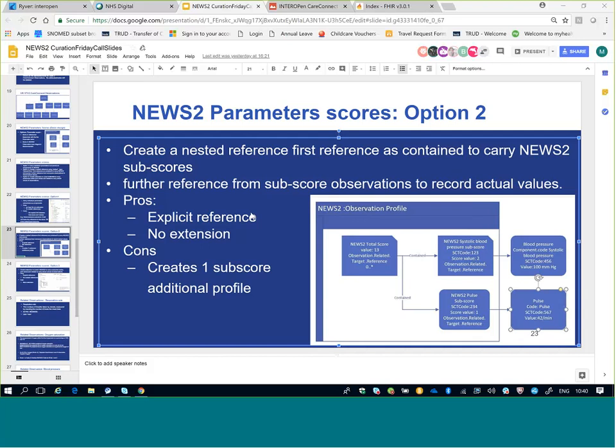And I wondered whether you had considered that, or if there's space for that under comments or observation at higher level observations. So for example, one of ours says send a notification to the clinical care outreach team, and the other one sends to the clinical response team, and then you make some free text comments about what you want to tell that team. So I would add that to the total score overall.